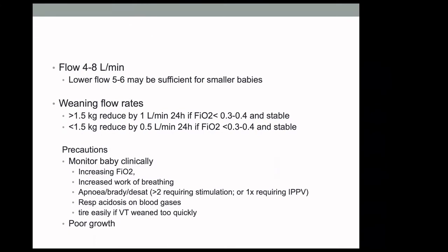So CPAP and Vapotherm are similar. Good practice is similar for both of these modalities. You need to look at the oxygen requirements, look at the baby clinically from an ABC point of view, looking at how they're breathing, how comfortable they are, looking at the past day or two to see if there have been any changes in the apneas, bradys, or desats, and looking at the trend on the blood gases.